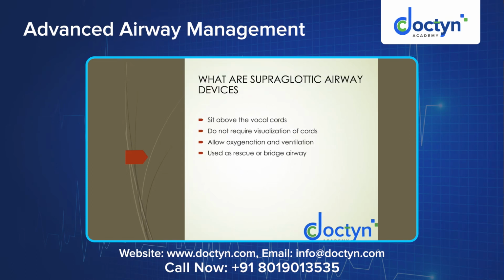So we'll go to the supraglottic airway. One adjunct, as we have finished, is the oropharyngeal airway, which is used to keep the airway patent during bag mask ventilation. So next one is a supraglottic airway device. We are going slightly deeper in this particular airway, where now we have put an airway only till the oropharynx to maintain ventilation. This supraglottic airway device is just putting a mask not on the face but directly over the vocal cords, where the air has to directly get delivered. That will be supported by one tubing, to which you can connect a circuit or an ambu or anything. So it will just sit directly above the vocal cords.